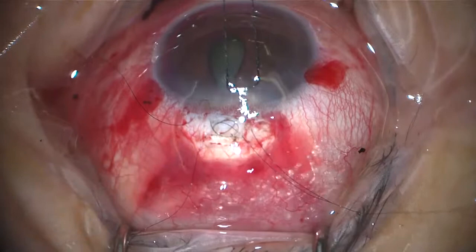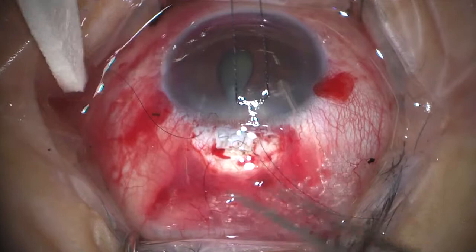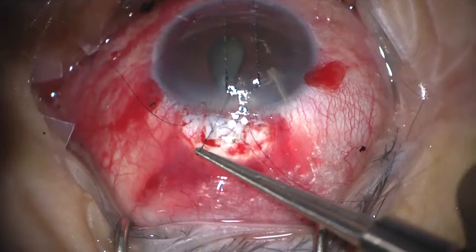I think tying forceps. I think we'll just tie one of these sutures first, just so we're closing the eye a little bit, and then it will be easier, I think, to replace the iris. So you can see the small loop here, we're going to tie that on four throws. One, two, three, four. When there's a lot of iris coming out, I want to make sure that the eye is as secure as possible, just in case anything else comes out. So I just want to at least tie one of these sutures.